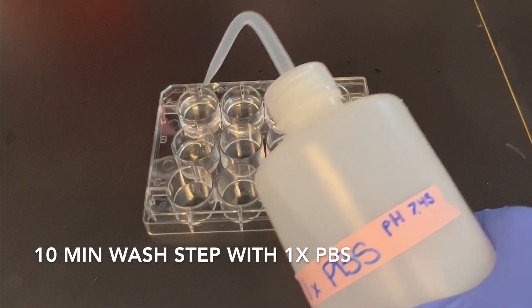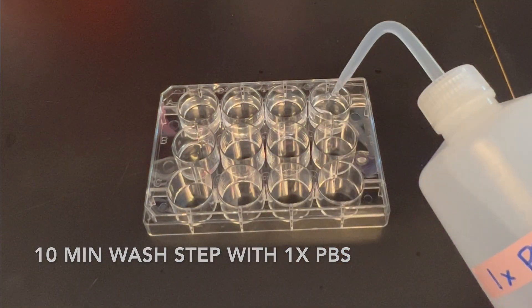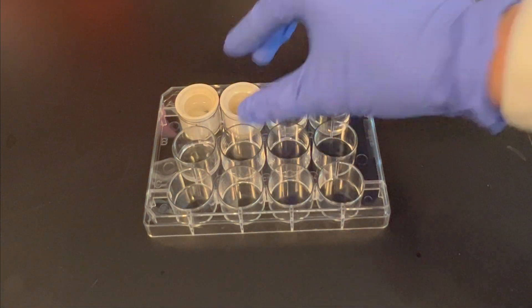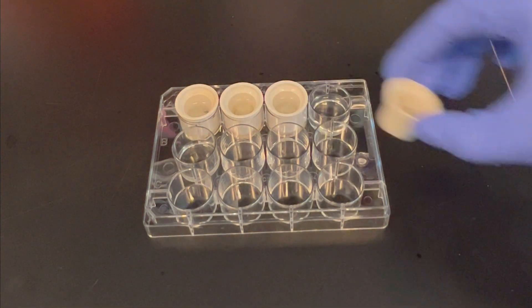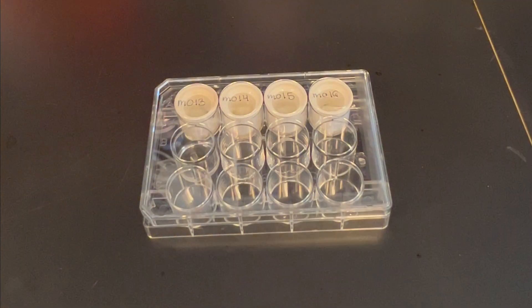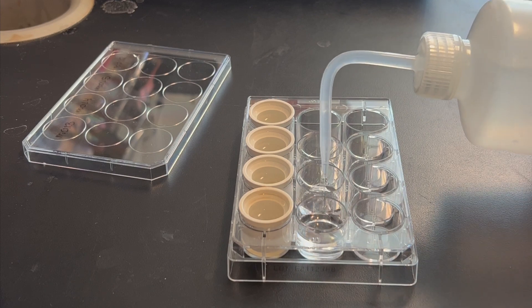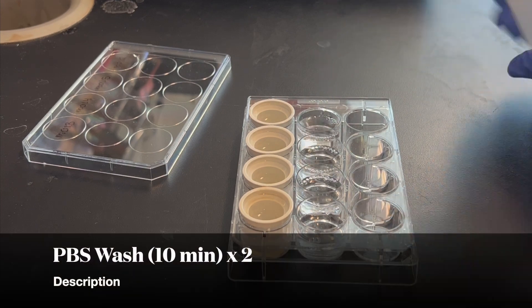Begin by retrieving the desired tissue for staining from its storage. Here we are using 50 micron brain sections from rats that received a single BRDU injection 2 hours prior to perfusion. The first step is to perform a 10-minute wash step using 1x PBS. Add PBS to a 12-well plate and gently transfer your tissues to the wells. After placing the wells on a shaking belly dancer, repeat this step for two more times.